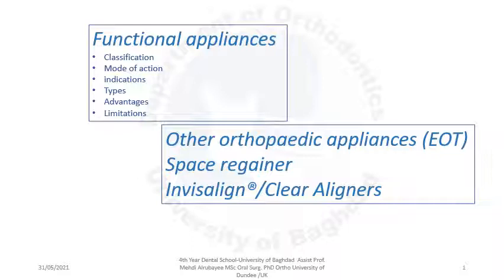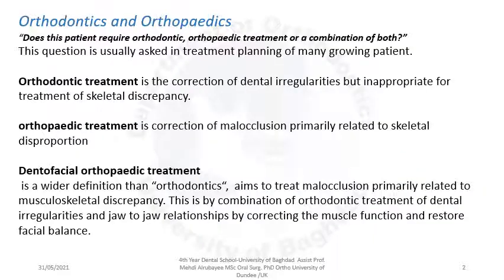Mahdi Arubei. Our lecture today is functional appliances, classification, mode of function, indications, types, advantages, limitations, and other orthopedic appliances that are extraoral traction appliances, space regainers, Invisalign or clear aligners. Orthodontic and orthopedics.